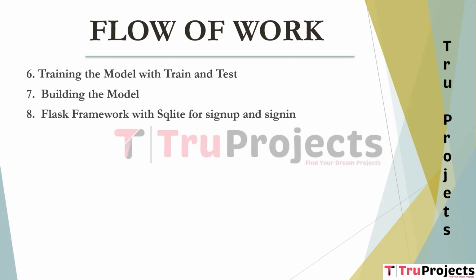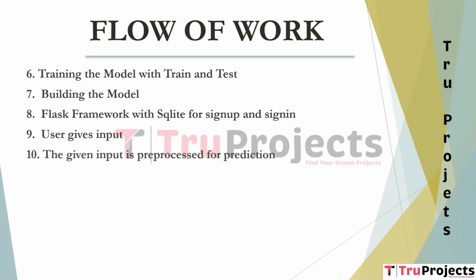Flask framework with SQLite for sign up and sign in. In this step, we set up a Flask web application framework with an integrated SQLite database to facilitate user registration and authentication. This enables users to access the prediction functionality. User gives input. Users interact with the web application by providing input, typically in the form of an image related to diabetic retinopathy. Input pre-processing for prediction. The given input by the user is pre-processed to make it suitable for model prediction.